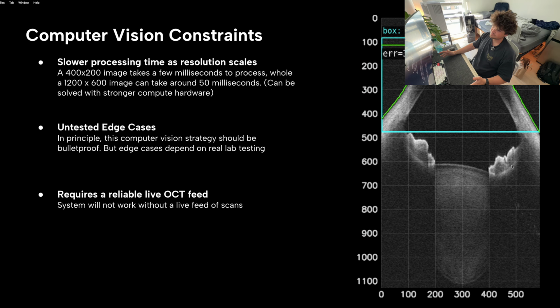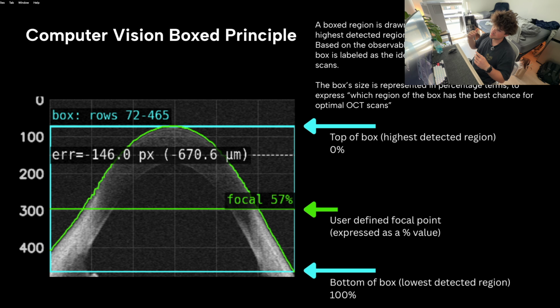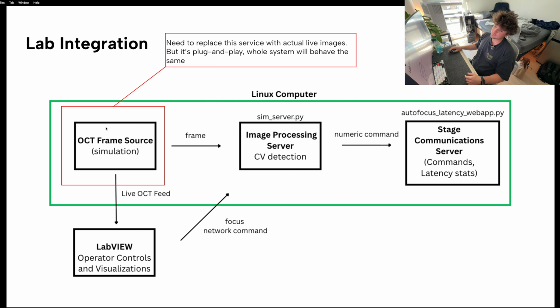Some constraints with computer vision, of course, is processing time, which the good thing about that is as our hardware scales, the processing time will also become a lot faster, but it means that we need to be mindful of image sizes. How can we declare a window where the scans are going to be the highest quality? Draw a box with the top of the box being the highest detected surface and the bottom of the box being the lowest detected surface. Now that you have this entire box, you can split the region proportionally so that you can set a focal point somewhere in that box where we will later discover is the most optimal point for scans. Lab integration will just require the swap out of the OCT frame source. Everything else can stay the exact same.